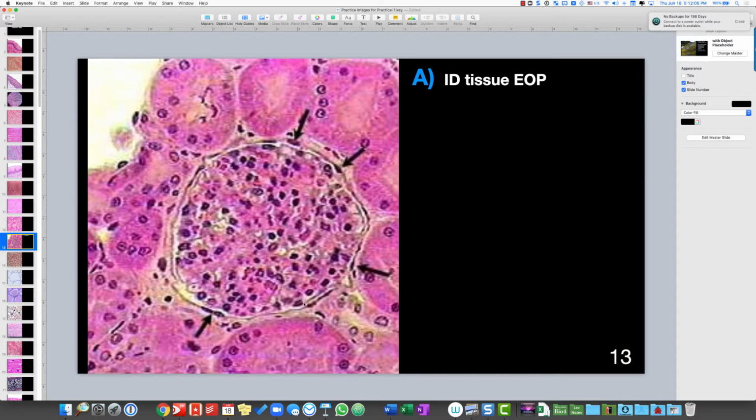Okay, this renal corpuscle then continues into the renal tubules, also known as kidney tubules. So these sections are probably interconnected, continuous with one another actually. They're just coming in and out of the plane. So you can see that in kidney you've got a lot of different types of tissue. At least within this image, you can already see two types. You can see the simple squamous epithelium, and you can see the simple cuboidal epithelium. The renal tubules are made up of simple cuboidal epithelium.